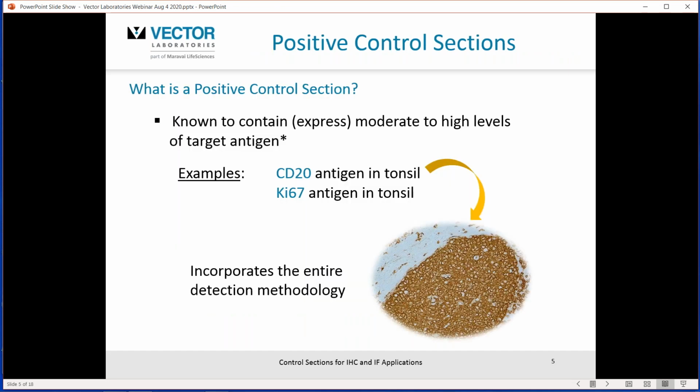Okay, so let's get into positive control sections. What is it I'm talking about when I refer to a positive control section? A section that's known to contain or express a moderate to high level of target antigen. And I've got an example here of a B cell marker, CD20, in tonsil. It's showcased by the image here of a nice dark DAB staining where you'd expect it to be. Certainly, this would be an appropriate control or positive control for this antigen in this tissue. I've got another example there of the Ki67. You could also use that in tonsil.